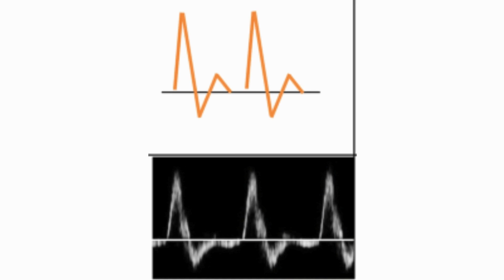Okay, let's break it down. Imagine blood flowing through a healthy artery. It pulses, then briefly reverses, then pulses forward again. That's triphasic, a strong, resilient wave. Triphasic is normal. You'll hear 3 sounds. It's crisp, it snaps. Think of it like a drum beat.